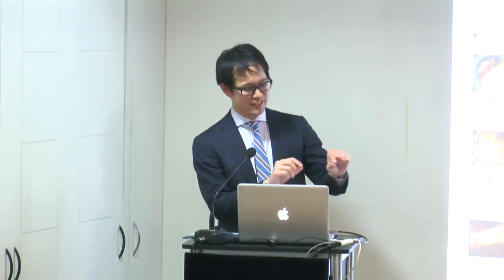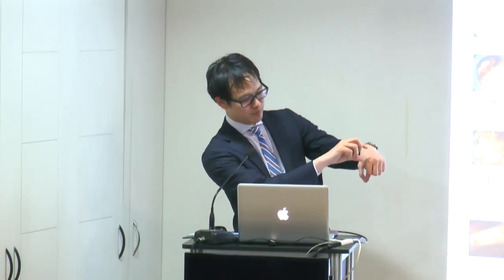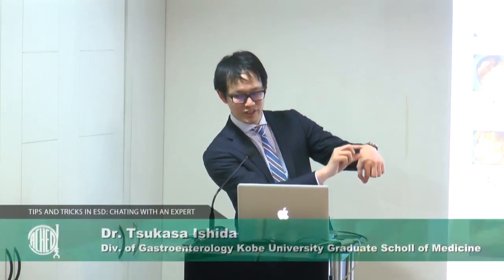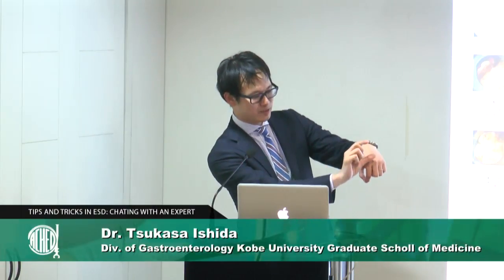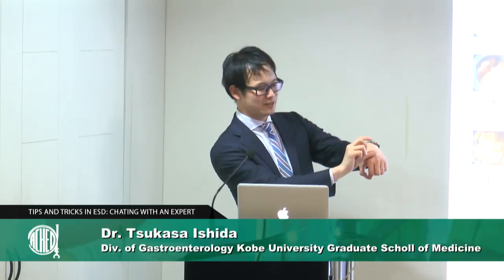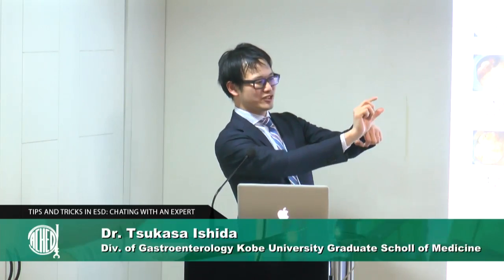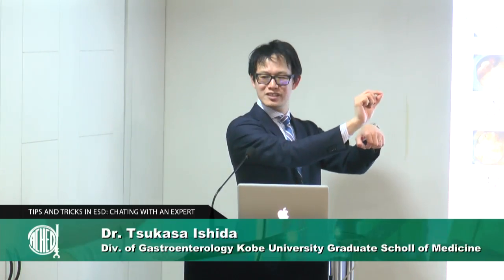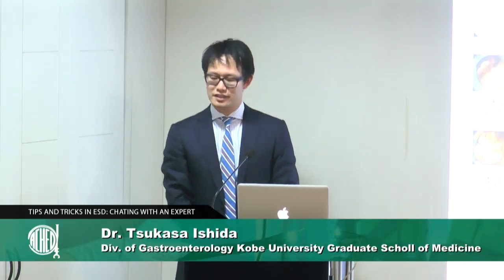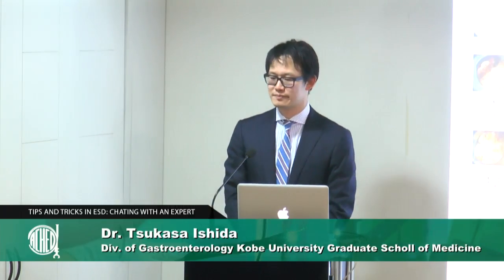Sorry, the first clip is attached to what? To the tumor edge. And then the clip has strings, with a loop? Loop. And then you grasp the loop with the second clip, to the opposite wall. Healthy wall. Healthy mucosa. Yes. So, what company released that system?